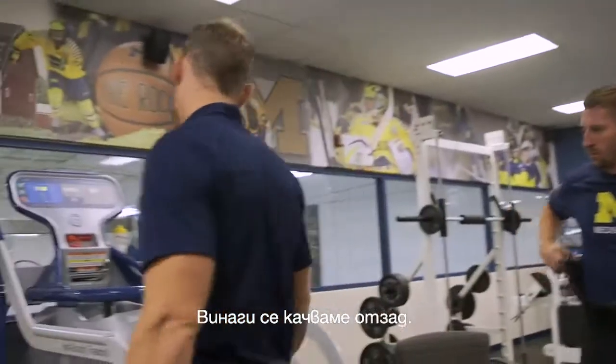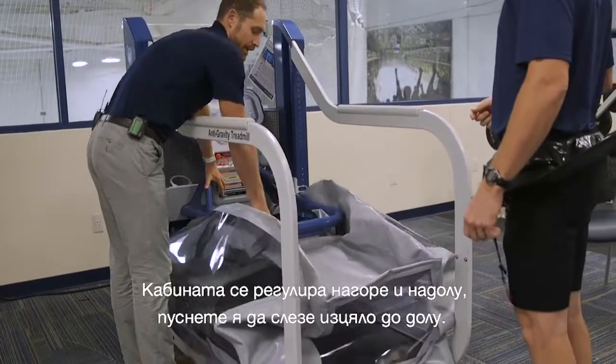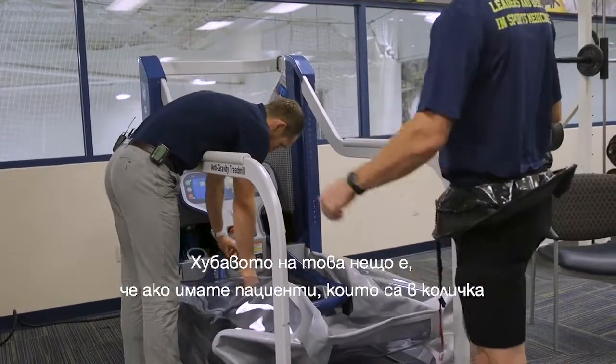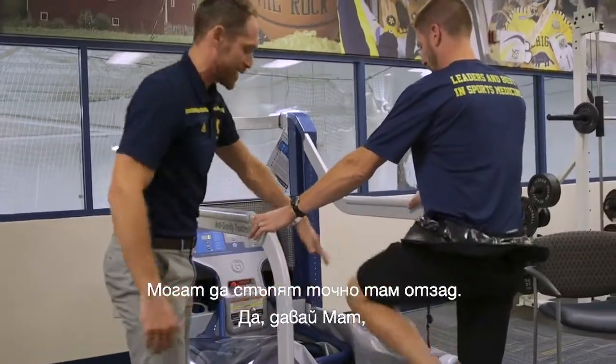We always enter from the back. The cockpit adjusts up and down, so we'll put it all the way down. The nice thing about this is if you have a patient who might be in a wheelchair or with an altered weight-bearing status, they can wheel right up to it and step right on the back.